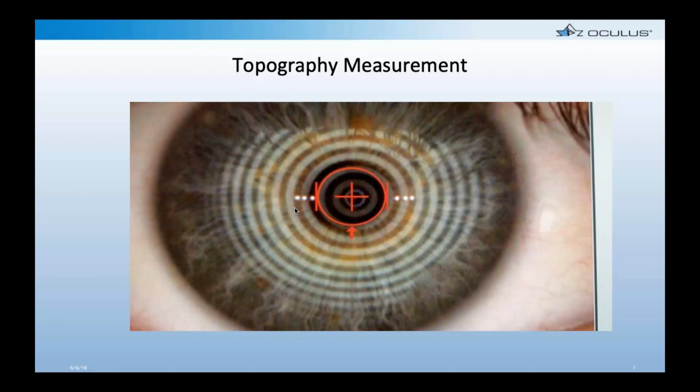And then next to it pops up their corneal topography with all of the analytical data about their cornea. It's extremely fast. And so again, from that point, I can glance at the map, I can choose to do another image, swing over to the left eye, and again, within about 5 seconds, I have taken my map and have the data in front of me.